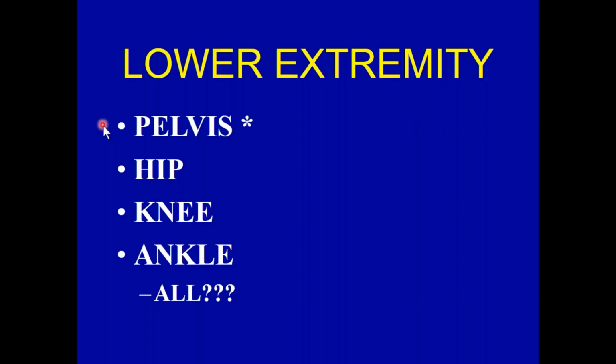So from an x-ray positioning point of view, if you have the patient stand pigeon-toed for all these examinations of the pelvis, you will get a more anatomically correct x-ray. And then for whatever reason, I simply extrapolated that to the lumbar spine, and I said, all right, if we do it in the pelvis, why don't we do it to the lumbar spine as well? So here you could add lumbar spine x-rays. I'm not talking about extreme pigeon-toed, 5 to 10 degrees, a little, whatever you deem it to be a little, is what we want. And then we can make judgments.